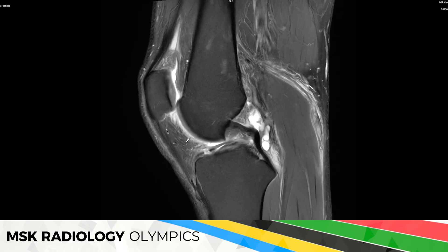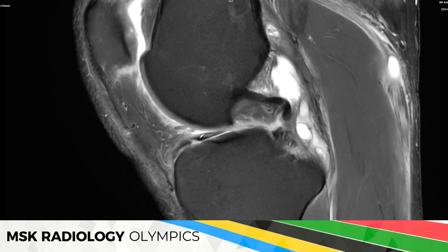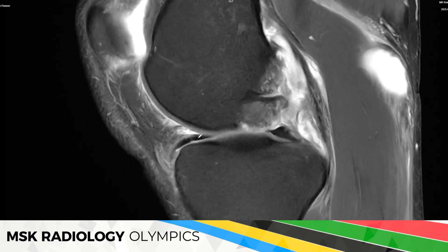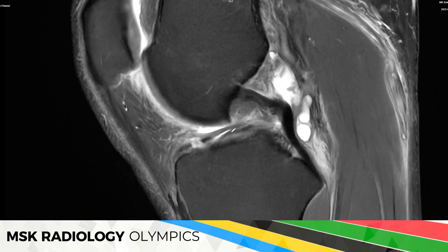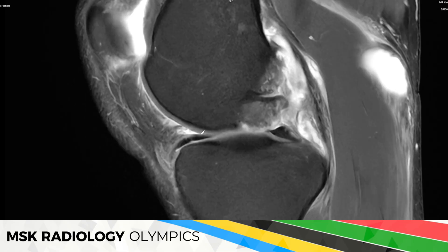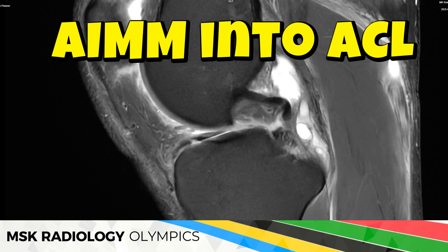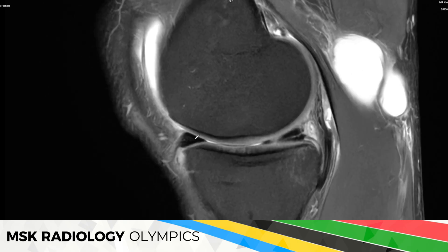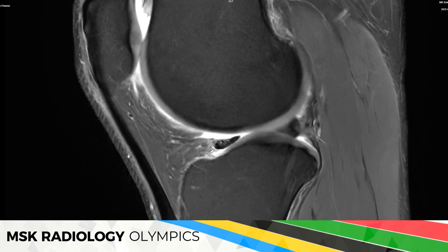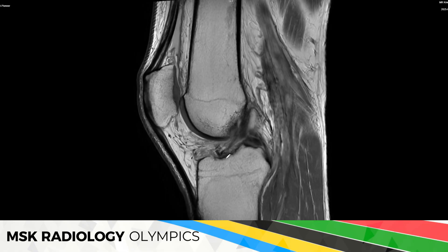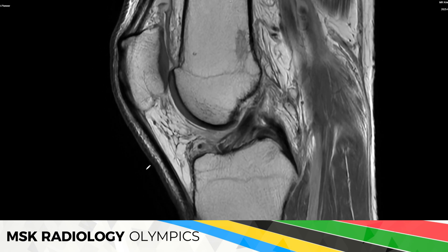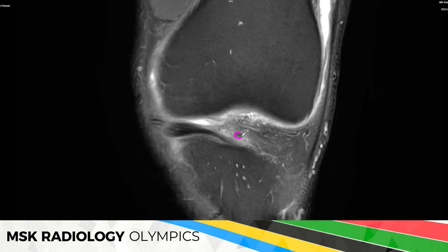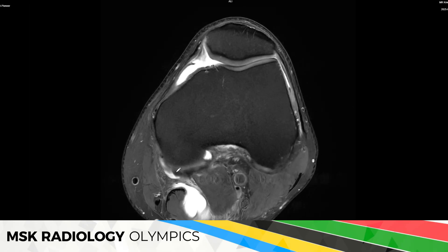There's no bone marrow edema on the femoral side. If you look carefully enough, you can see that the anterior root shows an anomalous insertion into the ACL — there is an additional band. You can see there is an additional string of tissue, one going down and the other seeming to go into the ACL. This is a variant called anomalous insertion of the medial meniscus into the ACL, or AIMM into ACL. It's an anatomic variant, not so rare. We don't see a proper transverse ligament here, and there appears to be a small ossicle or piece of meniscus nearby — perhaps visible on the coronal.